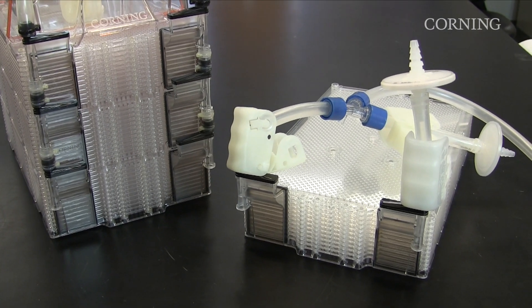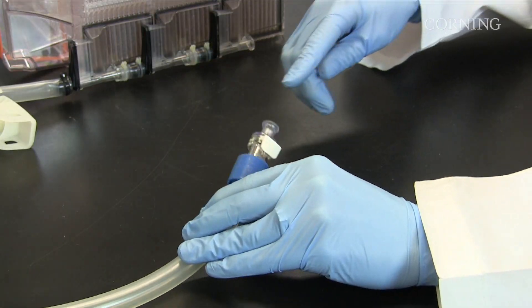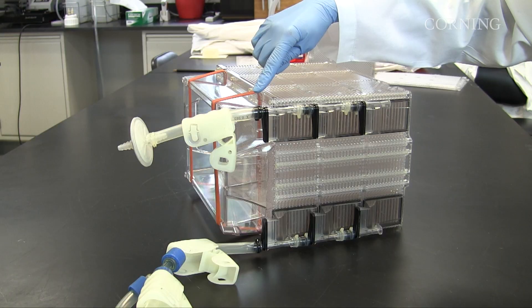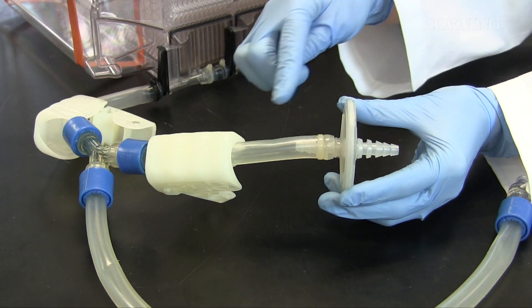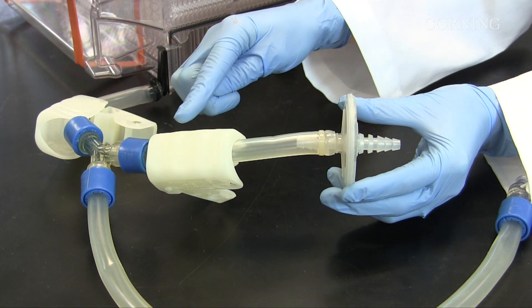The liquid handling tubing is used to make all closed system fluid manipulations. One end has an MPC quick connect; the other end connects to the liquid manifold. The vent tubing connects the vent filter to the air manifold. The chase tubing is part of the liquid handling tubing and is used to evacuate excess fluid from the liquid handling tubing.